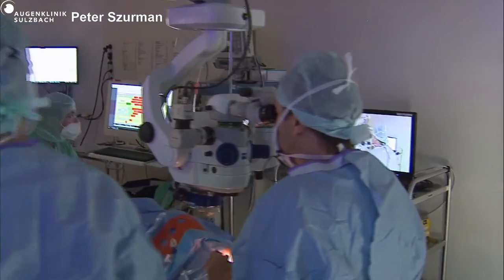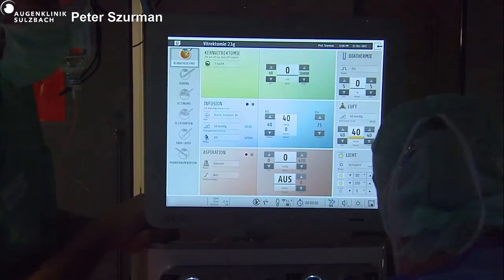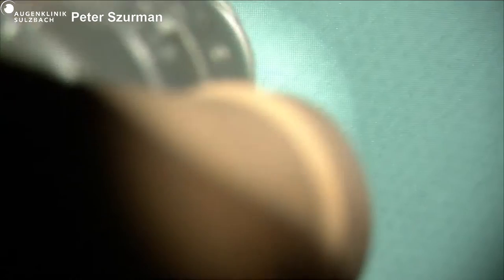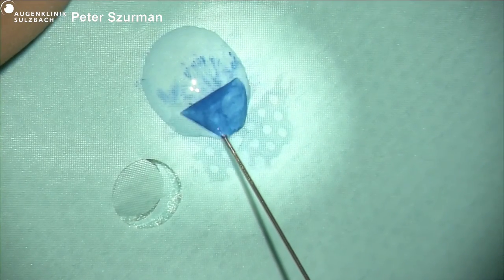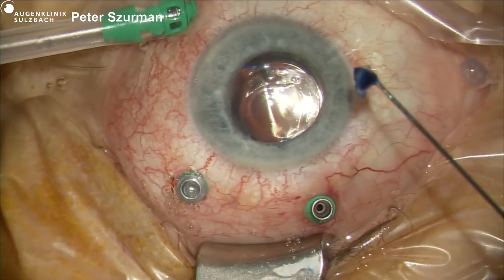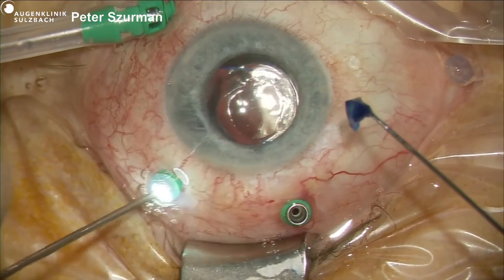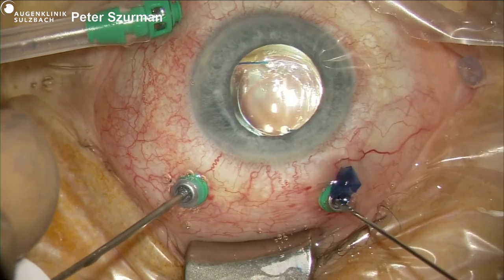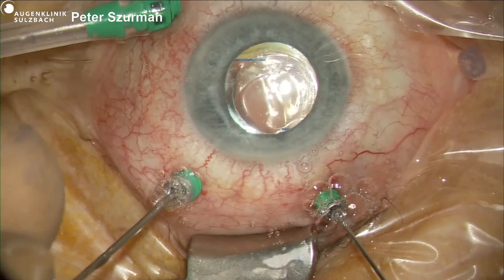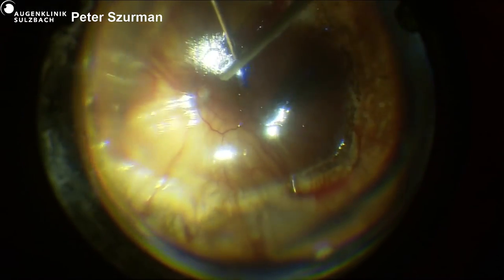Yeah, Grazia is right. Indeed, they asked me the alternative. I think the amniotic membrane is a good alternative, but if you don't have it in your OR, then I think retina is still a good possibility. In this setting it is important to maintain the right orientation of the retina, because if you put the retina with the photoreceptors on the choroid, they will survive. The retina remains elastic. If you put the other side down, the internal retina will be dead because you cut the retinal vascularization, and the photoreceptors cannot survive. The outer layers cannot survive because they are upside down and not in contact with the choroid. Then you end up with some scar tissue. So it's very important to keep the right orientation.